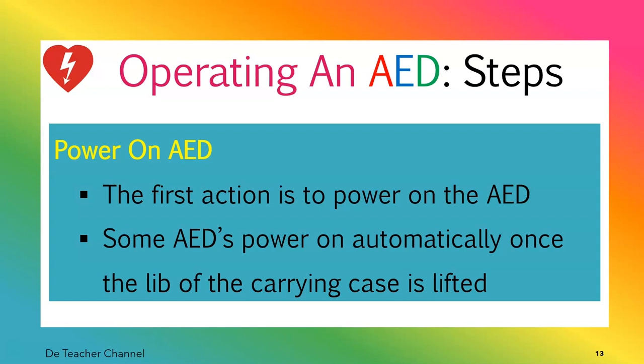So as soon as you bring it out, or as soon as you lift the lid from the case, okay, it powers on by itself. But not every AED has that ability. So if the type you use is the type that you have to manually power on, that is the first action. The very first action is to power it on.